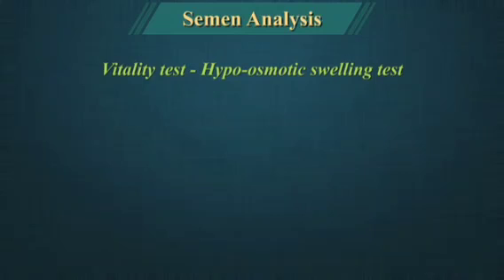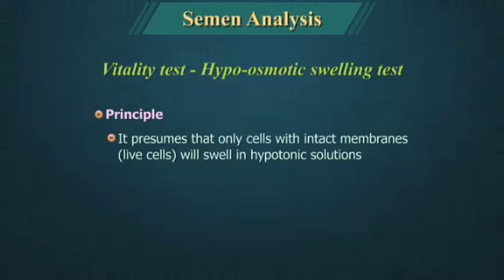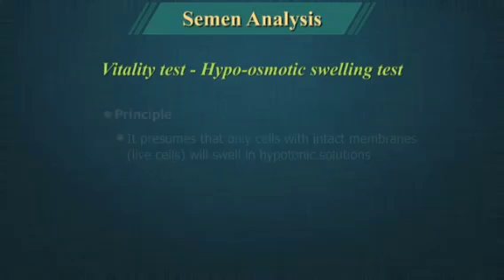Vitality test using the hypoosmotic swelling test is an alternative which presumes that only live cells with intact membranes will swell in hypotonic solution.